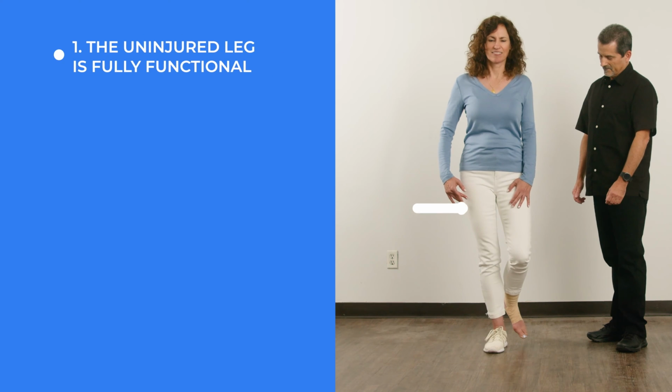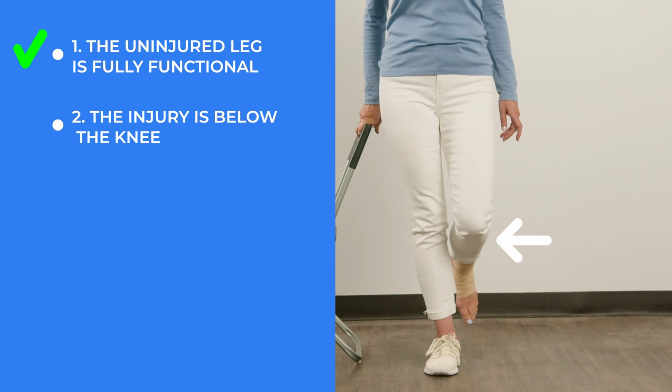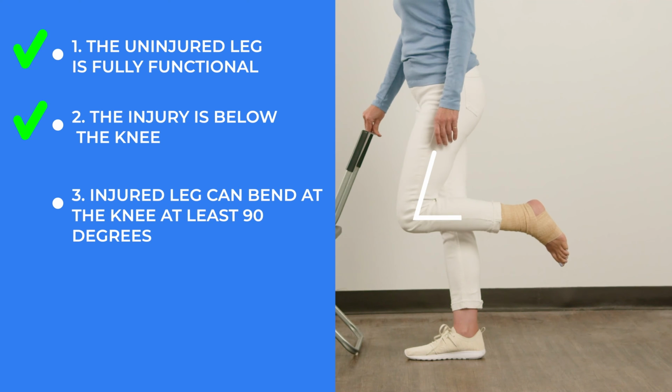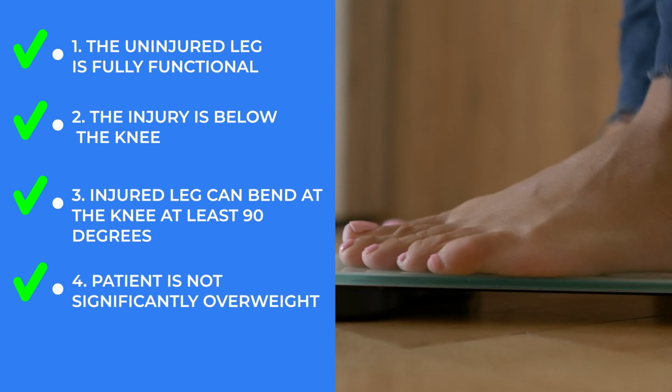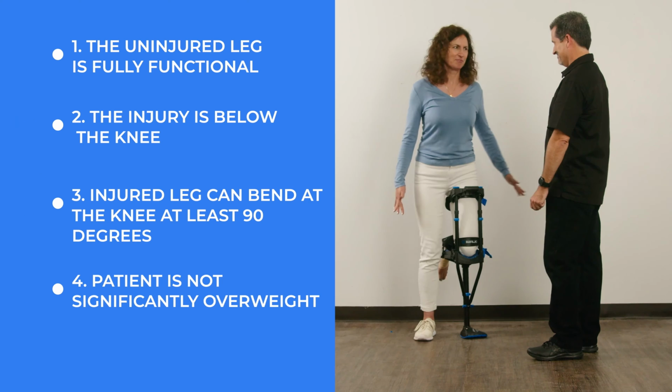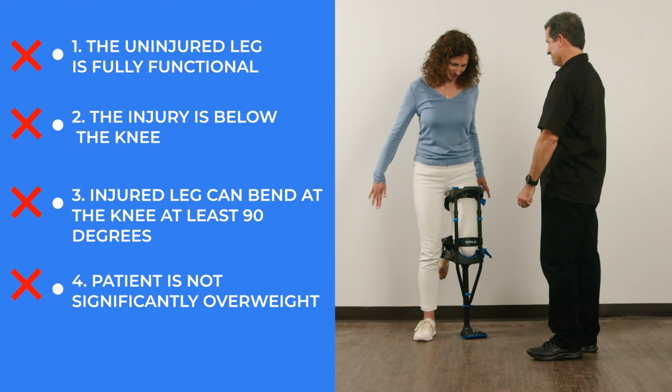Here are the rest of the physical requirements for use. The uninjured leg is fully functional. The injury is below the knee. Injured leg can bend at the knee at least 90 degrees. Patient is not significantly overweight. If your patient does not pass all of these requirements, then the iWALK crutch will not work for them.